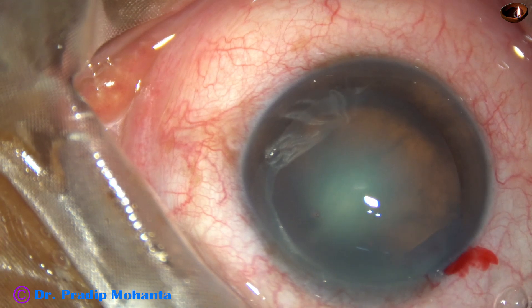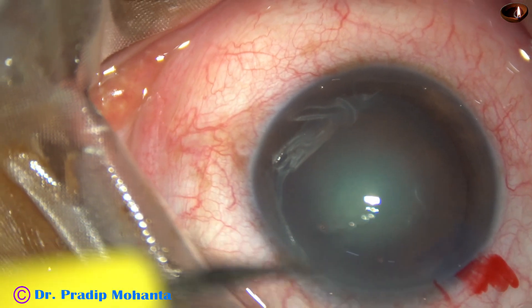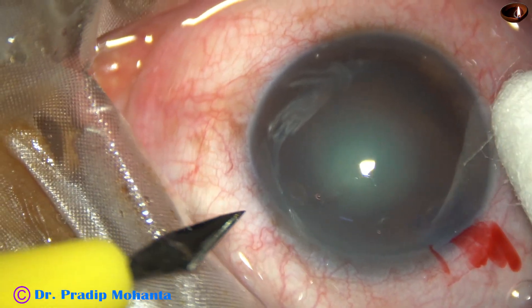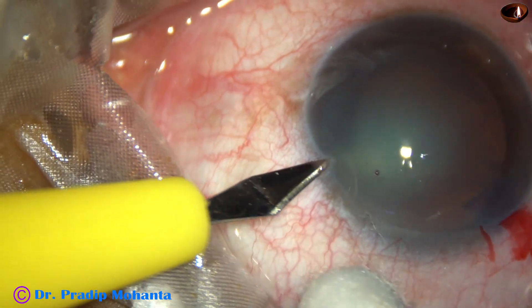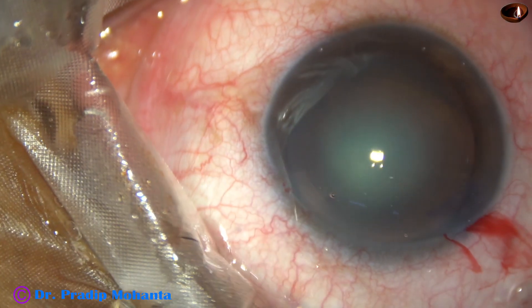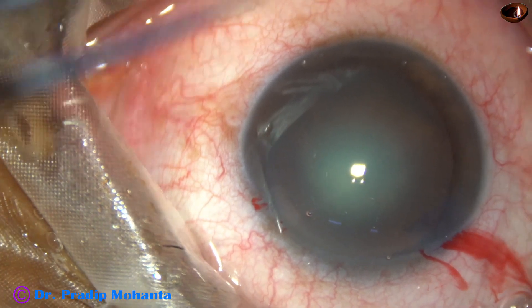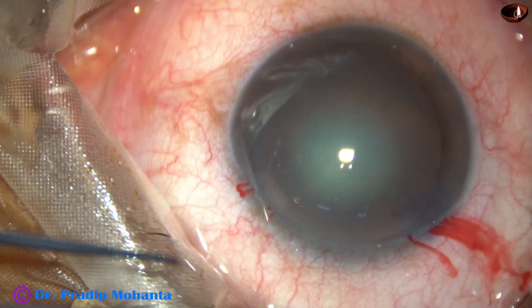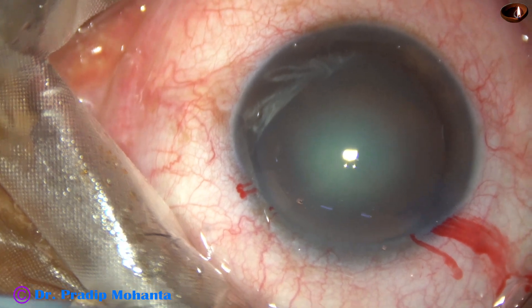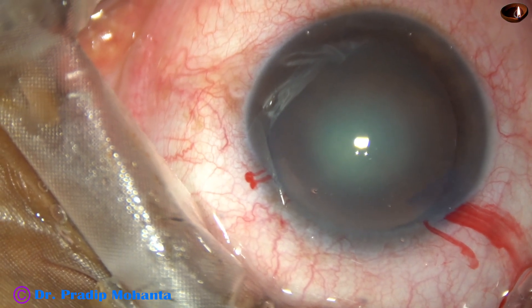The anterior chamber is filled with viscoelastic and it is applied over the corneal epithelium for better visibility. A side port is made and now a needle is used to cut the anterior capsule.